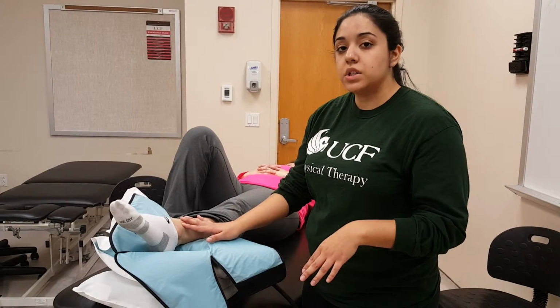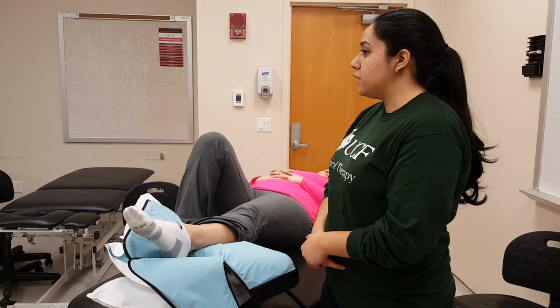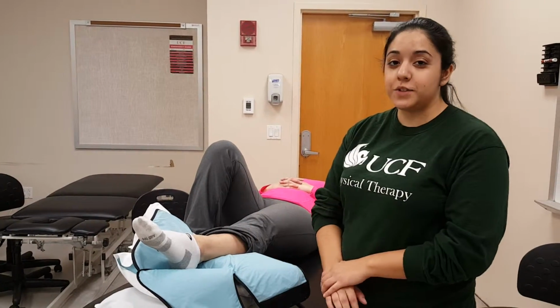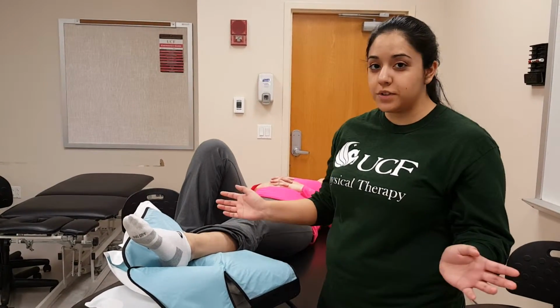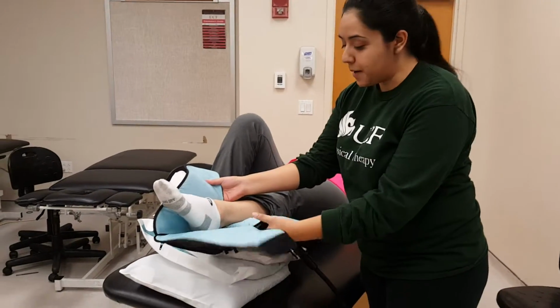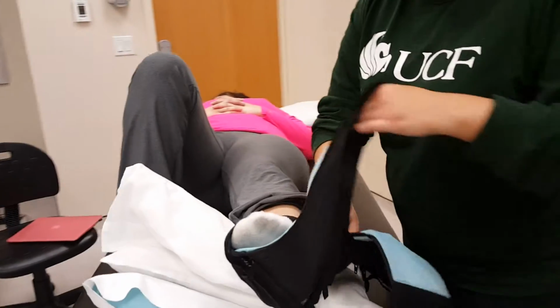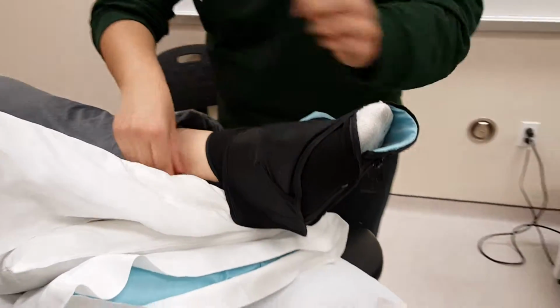Her color is good, and also, ma'am, can you tell me when you feel anything when I'm touching you? Yes. Good. She has good sensation. So we're good to go. So first I'm going to wrap her up with this cuff, as so.